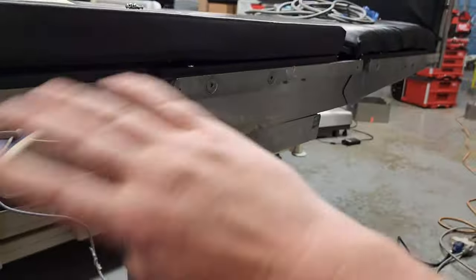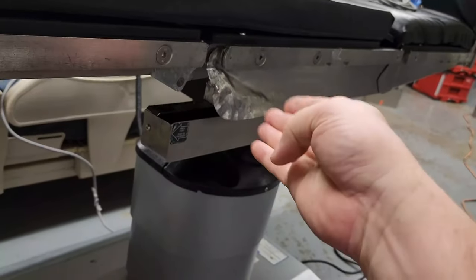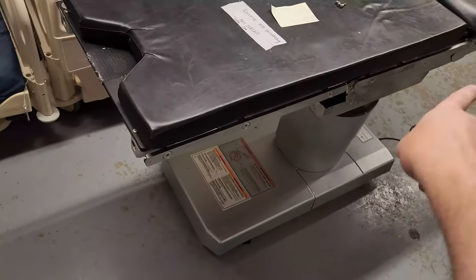This table has a table-side control plus all the normal functionalities. The Stryker 4085 is not my favorite table for reasons like these, but this one is going to be good to go with a new hand control and the replacement shroud.